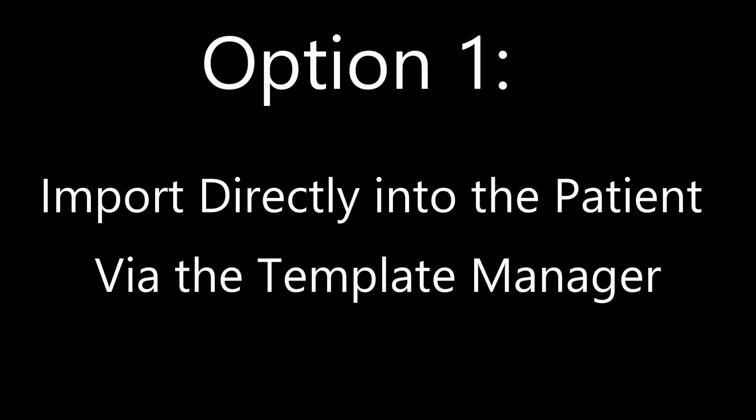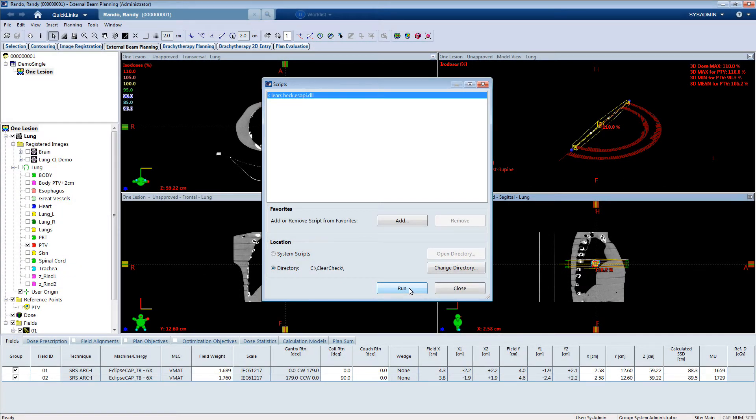There are two options for importing constraints into ClearCheck. This is option one: importing a constraint template directly into a patient via the Patient Template Manager. This will ensure that the template will only be used once and that all users will not have access to this template within the ClearCheck software for future use. If you never plan on using this imported constraint template again, this is a viable option that won't clutter up your global template constraint list.